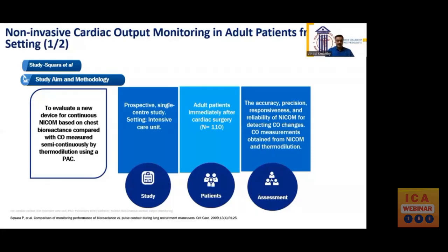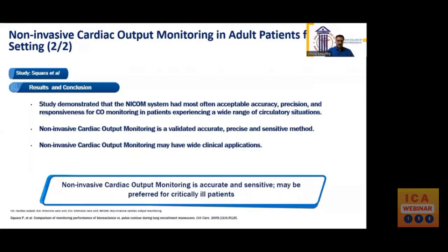Consecutive patients immediately after cardiac surgery in the ICU were a part of this study. And the interventions carried out were cardiac output measurements obtained from the NICOM and the thermodilution, which were simultaneously recorded minute by minute and compared in about 110 patients. The accuracy, precision, and responsiveness and reliability of the NICOM for detecting the cardiac output and its changes were evaluated. They opined that the non-invasive cardiac output system demonstrated acceptable accuracy, precision, and responsiveness for cardiac output monitoring in patients experiencing a wide range of circulatory situations.